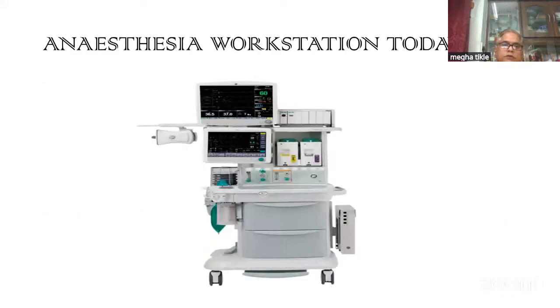So this is how the workstation looks today. Whatever you see of this is mainly electronic interfaces, modular monitoring system, screens for monitor, airway monitoring system, ventilators, which is integrated inside, and all the other systems that are required for us to deliver safe anesthesia.